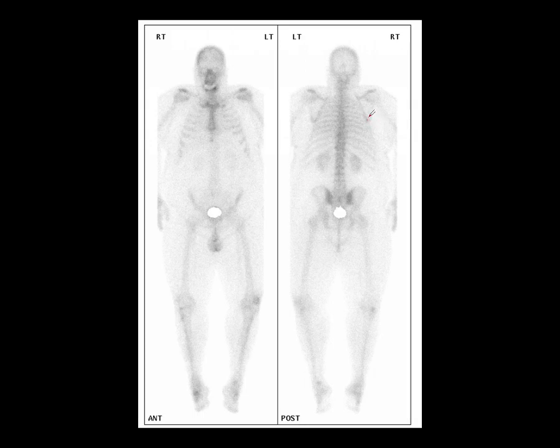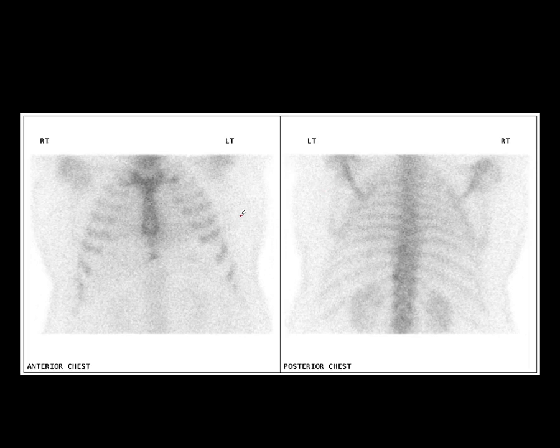It's usually due to the fact that the scapula is overlapping the rib, causing some increased activity. But I just thought we'd do an arms up view, like this, just to check that scapula and rib were okay. And that does look fine. You can see that area of prominent activity is still there. And you can see this lucency here in the lower sternum. So I know what these are, and I didn't need to investigate them any further.